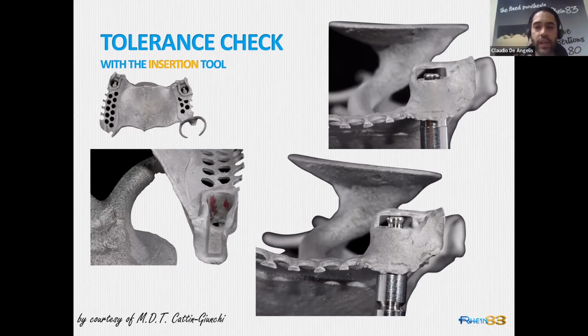So with this, you can understand if it has not enough tolerance here, because it will not touch the top of my cast box. And you just need to regroove a bit the inner side of my box.